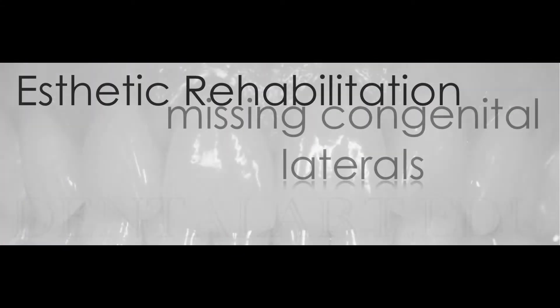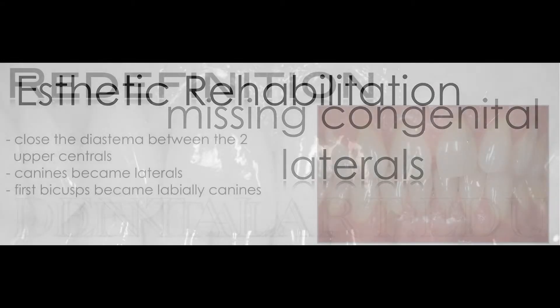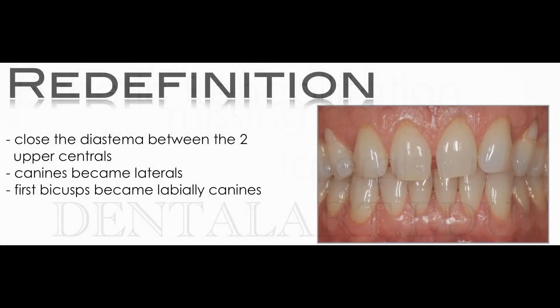I'd like to share with you one of the cases that we are dealing with in Los Angeles with the USC, actually with Dr. Jean-Ho Park, in aesthetic rehabilitation — missing congenital laterals.